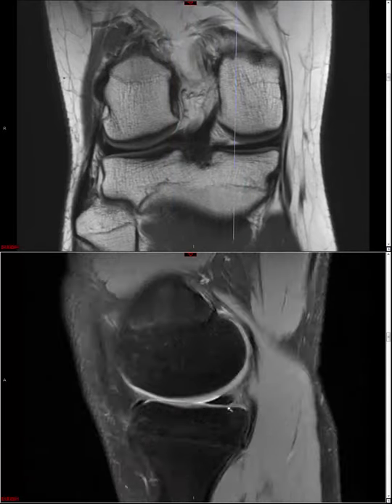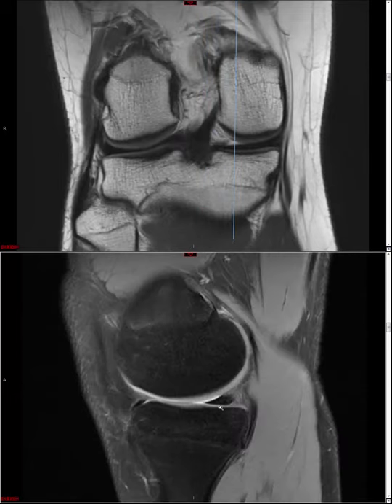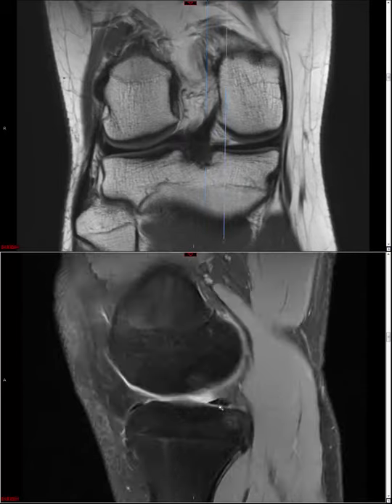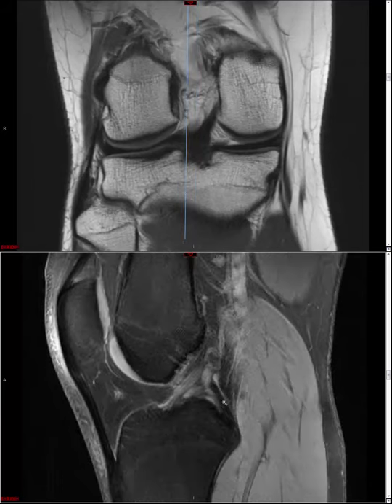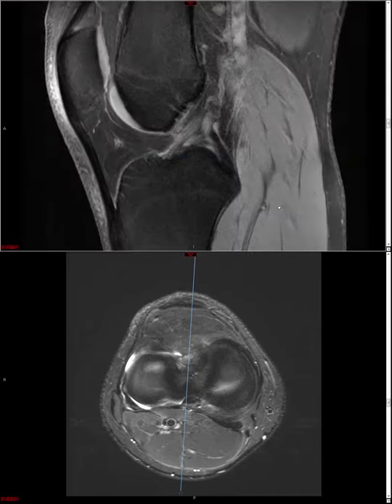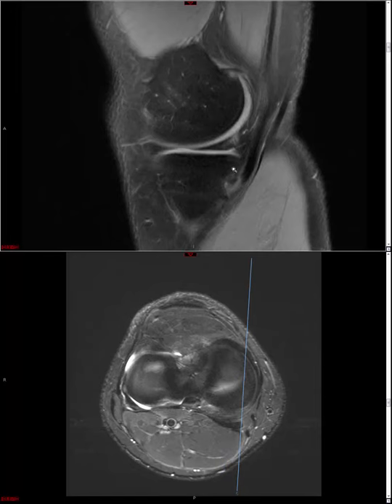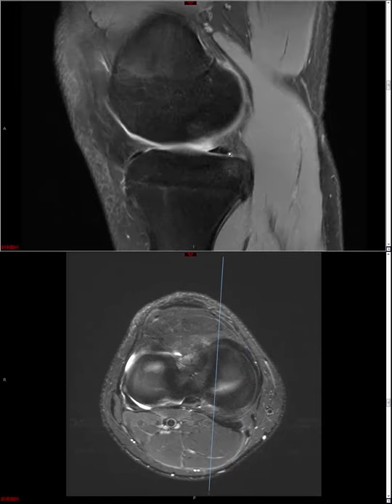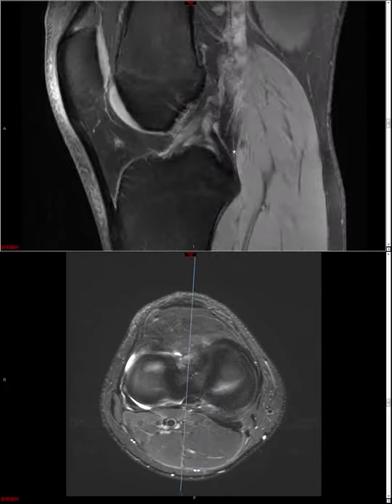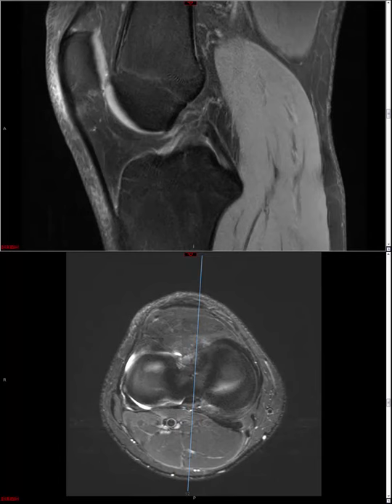And when you're starting out, I strongly encourage you to go through this exercise of ensuring that the posterior root attachments are intact, because if anyone's going to miss a meniscal tear early on, generally it's a posterior root tear, posterior root radial tear. And the reason for this is, I think people use the sagittal to look at the posterior horn, which is quite customary, and they scroll so fast that they don't actually realize that there's no posterior attachment, and then before you know it, you're into the other meniscus. Okay, so insist on seeing a nice posterior root attachment.